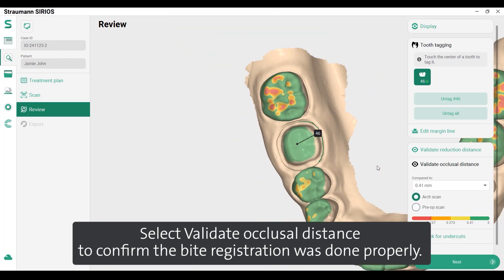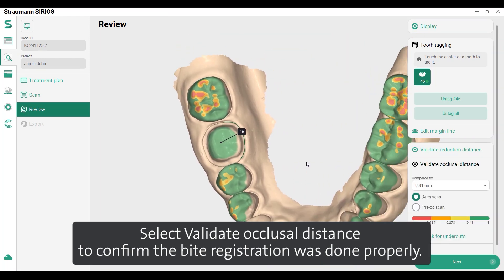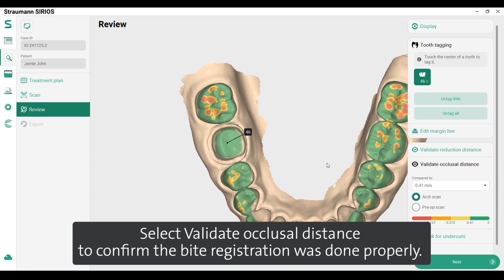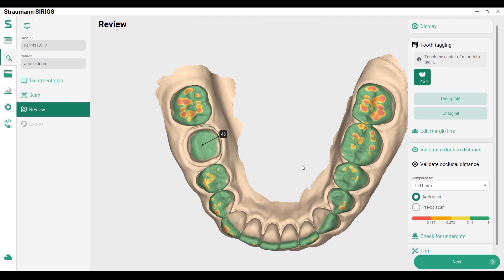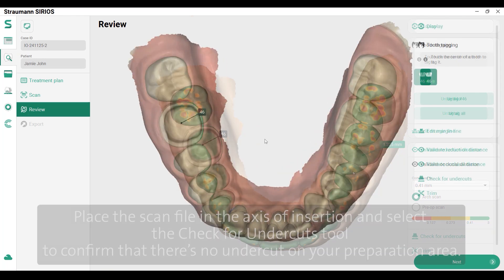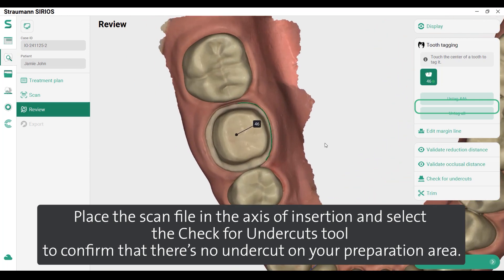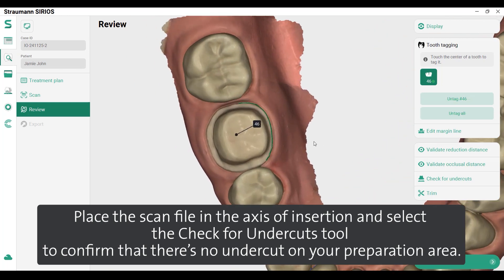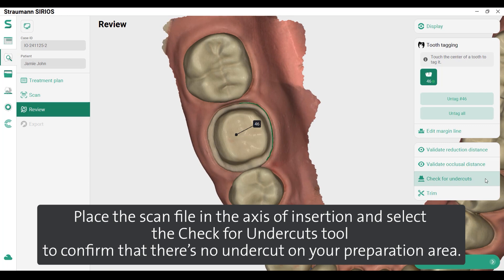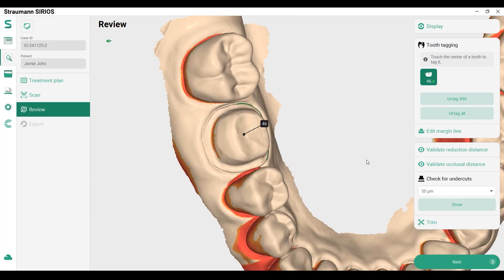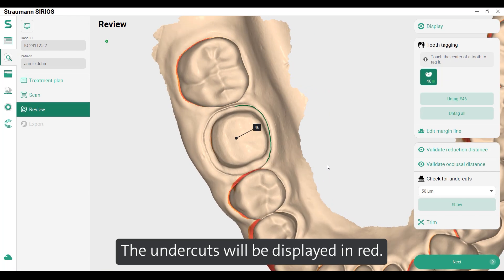Select validate occlusal distance to confirm the bite registration was done properly. Place the scan file in the axis of insertion and select the check for undercuts tool to confirm that there is no undercut on your preparation area. The undercuts will be displayed in red.